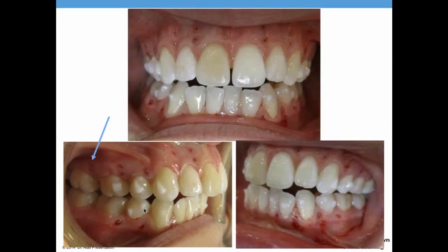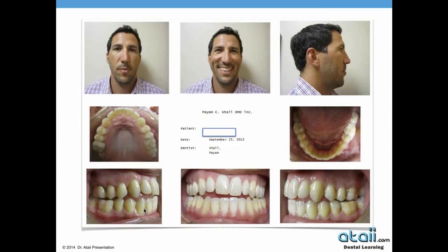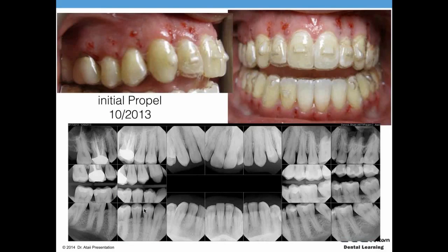And now we start to do a rubber band, and we started patients wearing their aligners for 3 weeks. We're cutting the aligner. Very difficult for me to track these patients. So our decision was to go ahead and Propel this patient. Again, very dense bone, very difficult to move these teeth. As you can see, that's where the Propel was introduced in between the teeth. And the patient was actually very compliant, wearing the aligners, changing aligners every week. And as you start to see the progress, from the time it was done to the follow-up, we already are working on the extrusions.